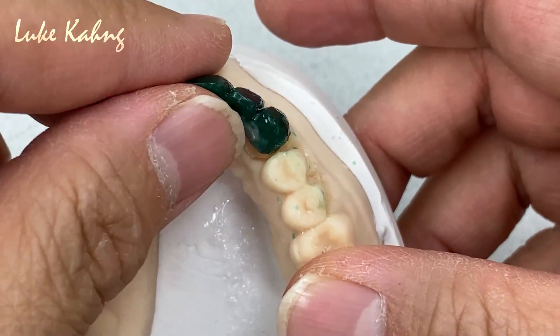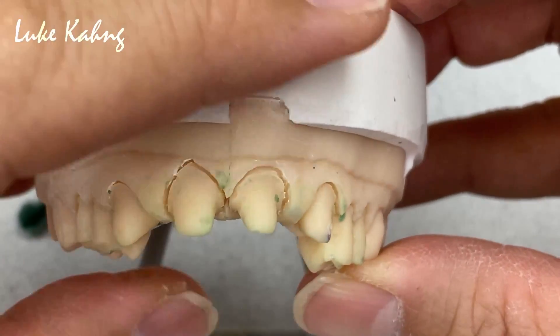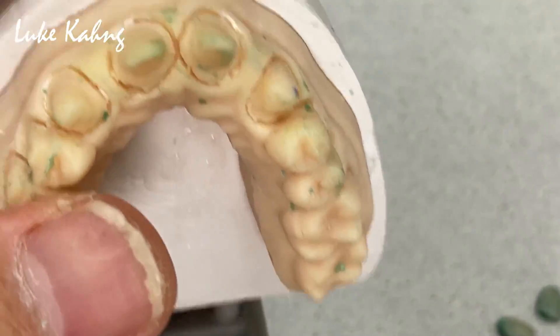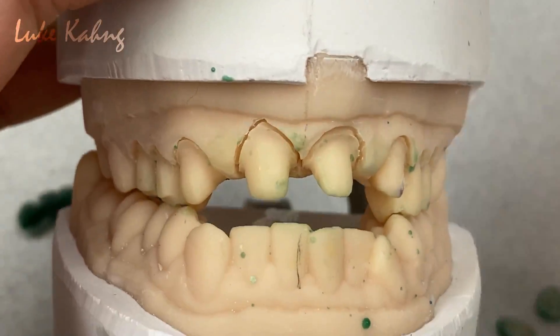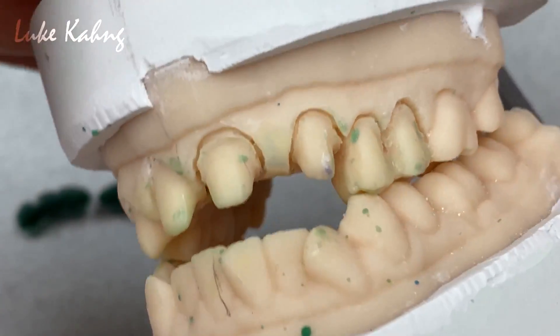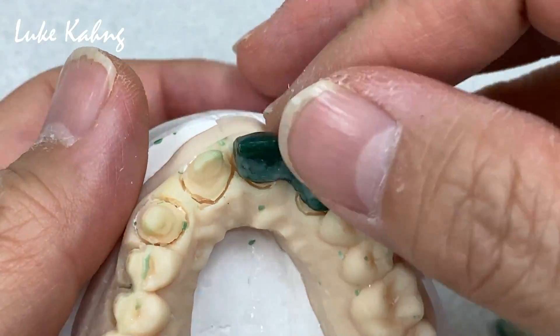I do not hesitate to make the lithium disilicate press compared to zirconia cases, because this is open bite — side view. So we hand wax and design.